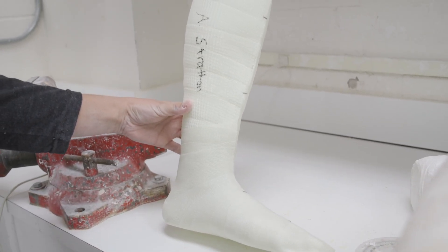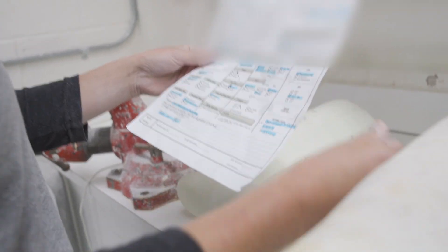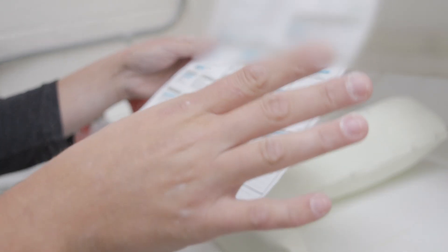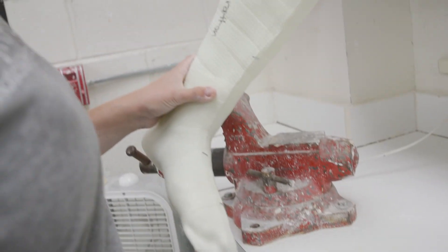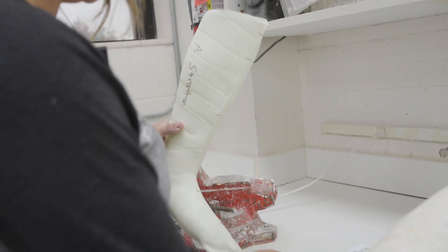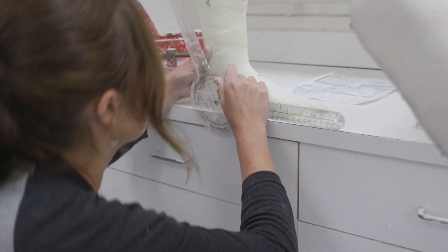So we first get a cast that's going to look like this. We're also going to get a worksheet that looks like this. First things first, you review all of the information to make sure it's correct and you understand it. The first thing we look at is what degree they want the ankle in — sometimes it's neutral — and you can know that degree by checking it here.